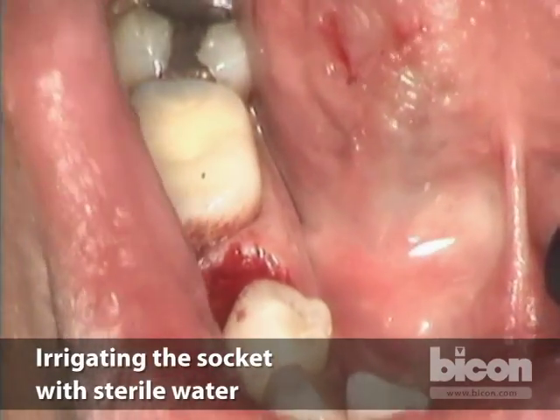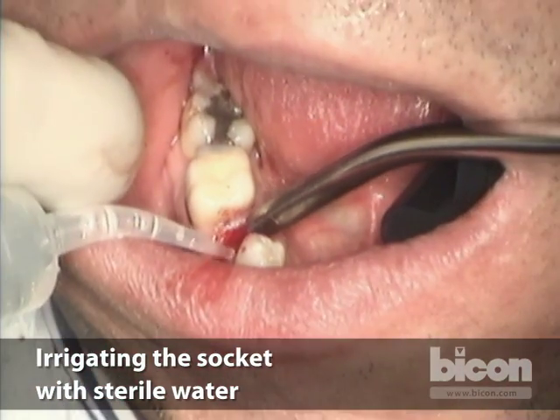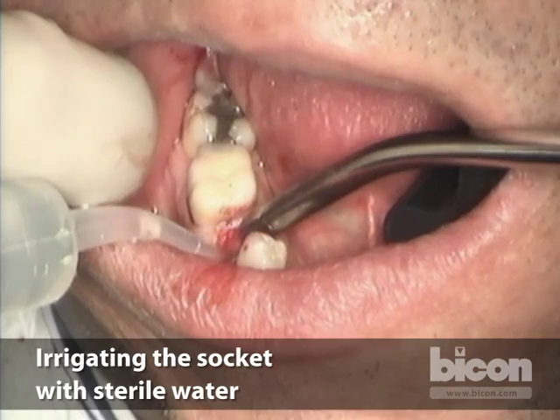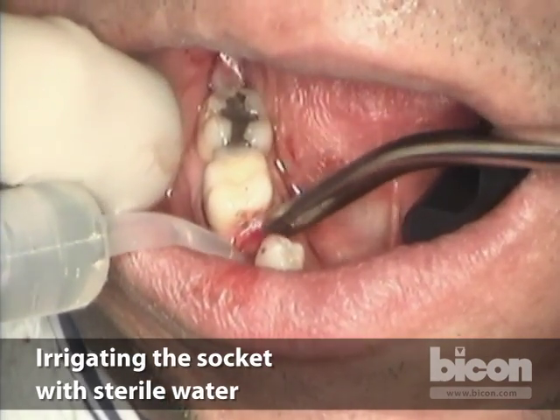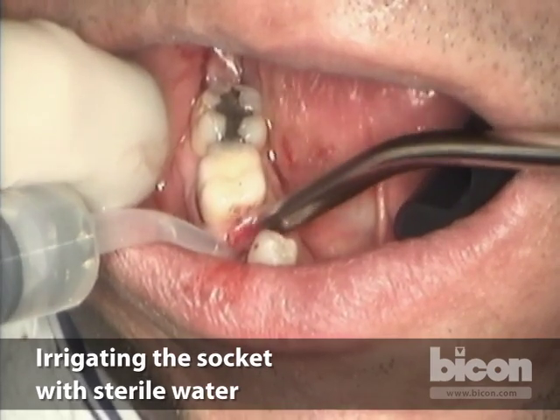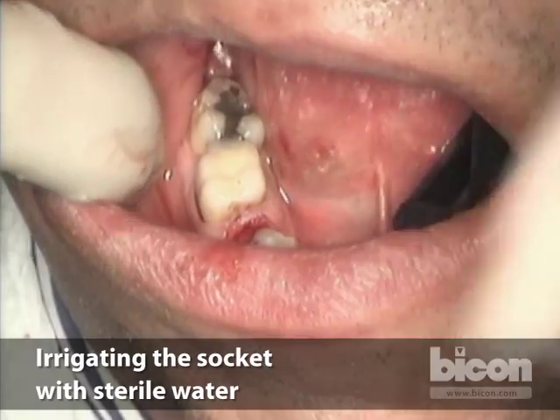Then we use a sterile water irrigation. We let it sit there for a little bit. If there are any bacteria or anything biological — even blood cells — there will be a burst because of the hypotonic solution.